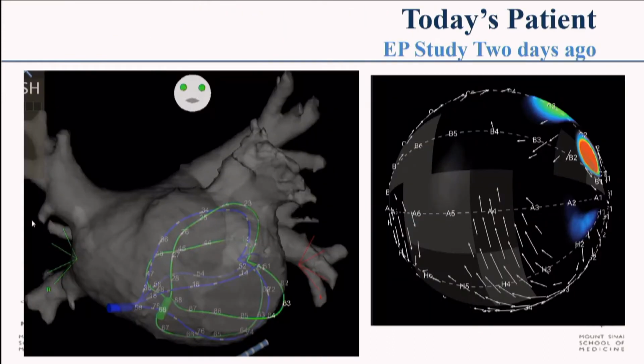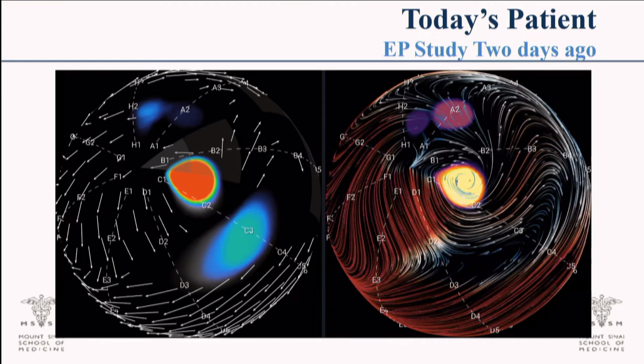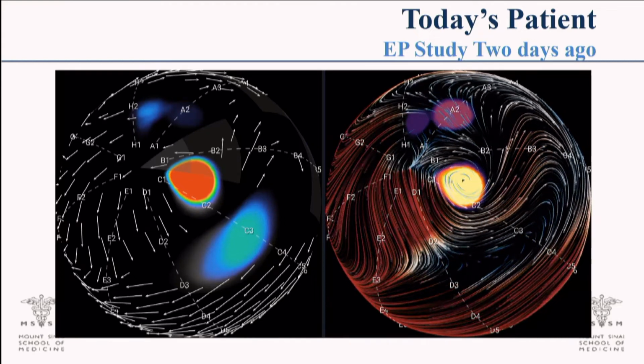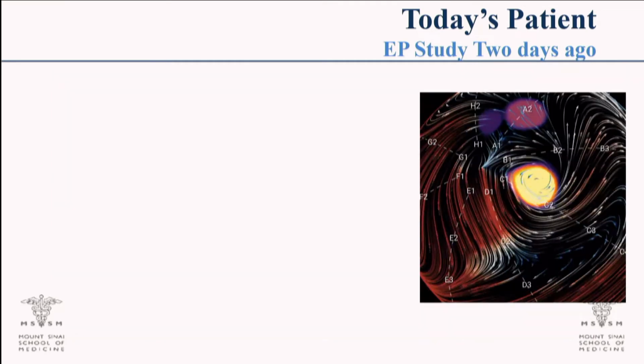Okay. So let's come back to today's patient. As you heard from Pavel, 2 days ago we had mapped this patient. That was the position of the basket catheter, and you can see a source up there. Let's splay it out. So this is actually the source. You can see on the left a static map, and on the right, you can see the activity is heading away from this.